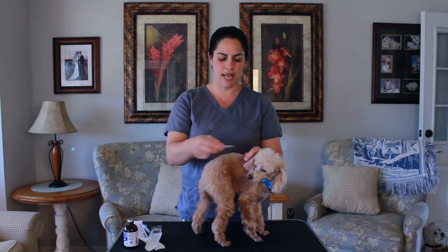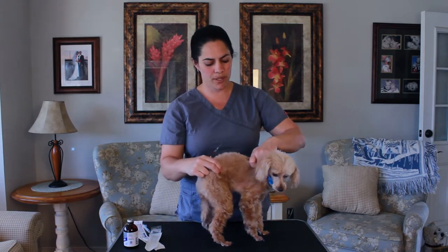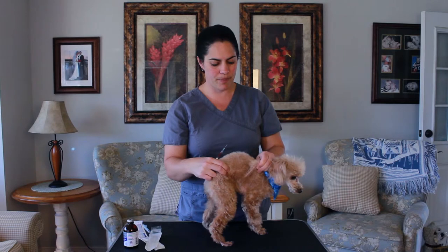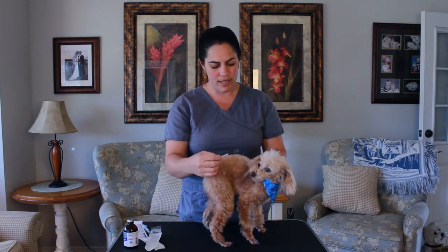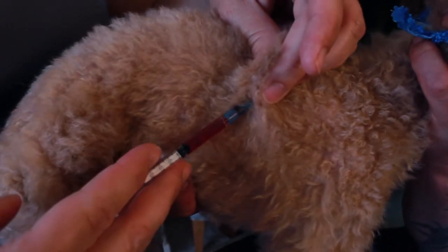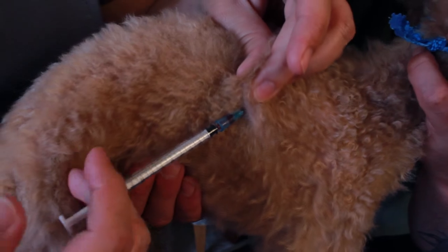Then you're going to take your needle cap off. You don't want to keep your finger on the plunger — if you keep your finger on the plunger, you're going to misfire. So you're going to hold up your tent like you're going camping, use your middle finger to make sure you're not hitting anything, and then insert your needle and inject. That's it.